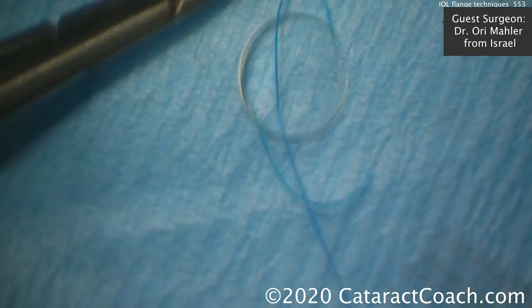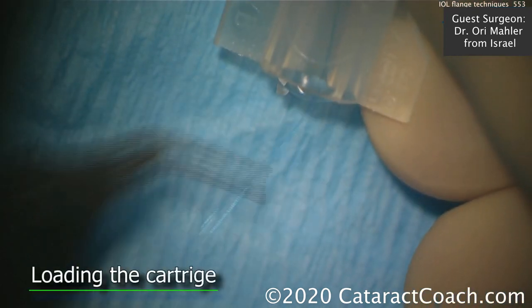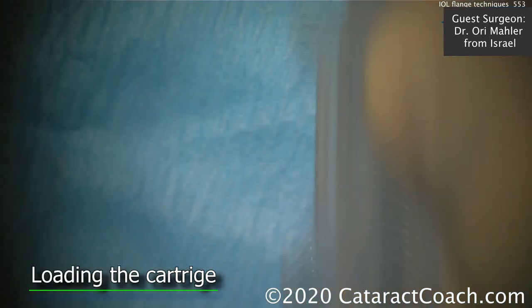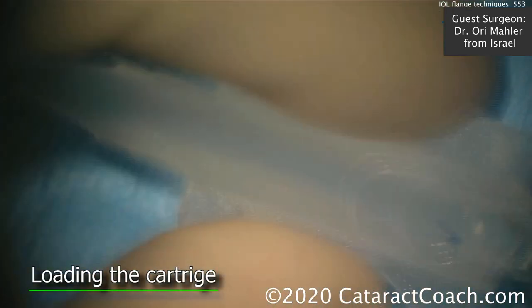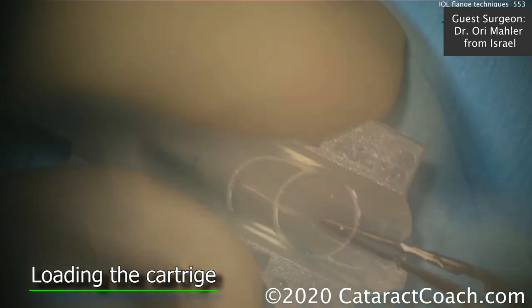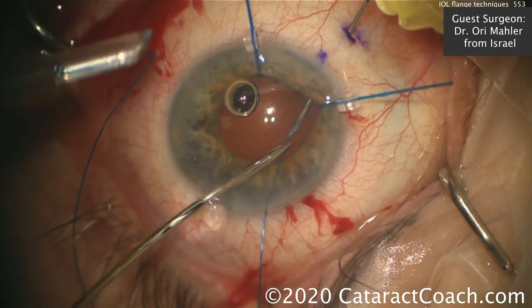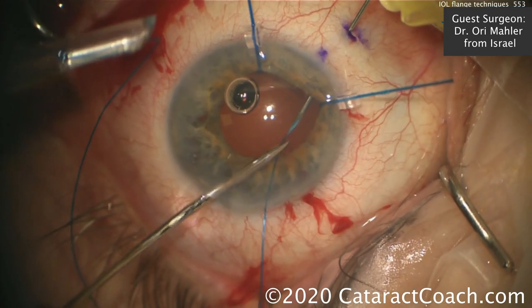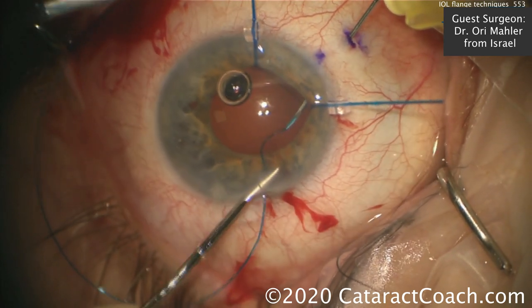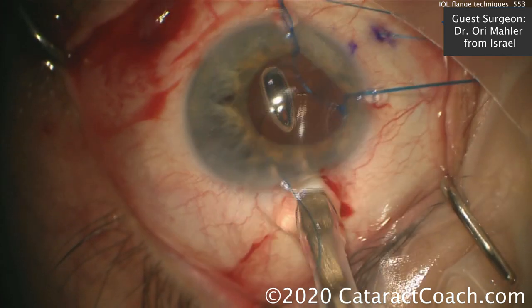Now we've got this 6-0 prolene suture that can act as a support for us. We'll load the long suture in the cartridge first, then load the IOL. This is a standard cartridge and a 6-millimeter three-piece acrylic IOL. When that's injected inside the eye, we're going to bring that one long suture out. Here's a 30-gauge needle, 2 millimeters back from the limbus. Feed this 6-0 prolene into the bore of that needle and pull it through the sclera, then inject the IOL.